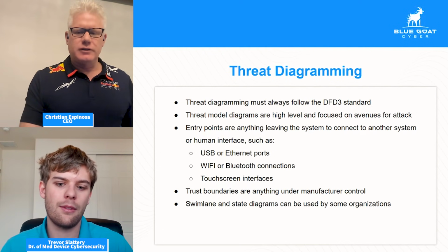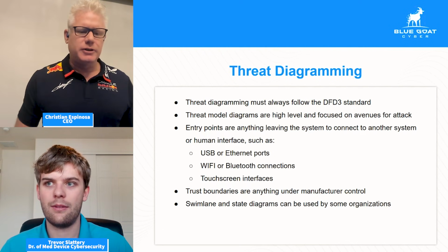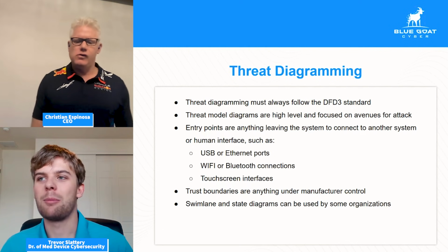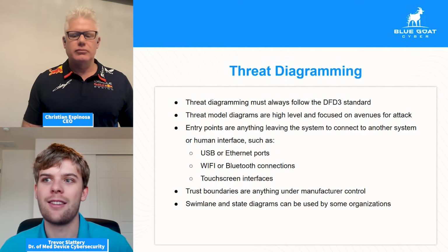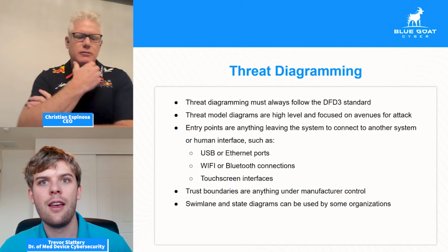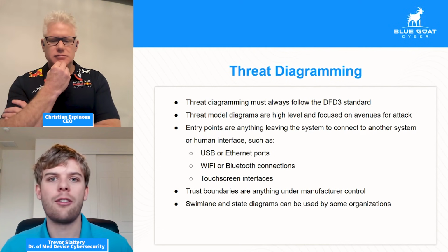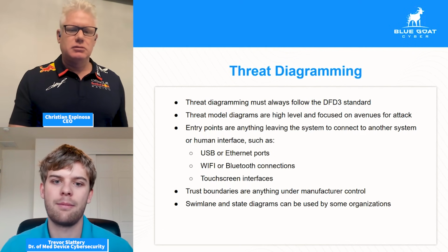Threat diagram from the MITRE playbook that the FDA recommends, as well as MDR, right? Yes, that's correct. So the MITRE playbook for threat modeling medical devices explicitly calls this out as a good standard to follow. Of course, there are other ones and custom ways of representing different objects. Sometimes it might not cover every type of object, but in general, it'll cover most cases. It'll cover most devices in a simple and concise way.